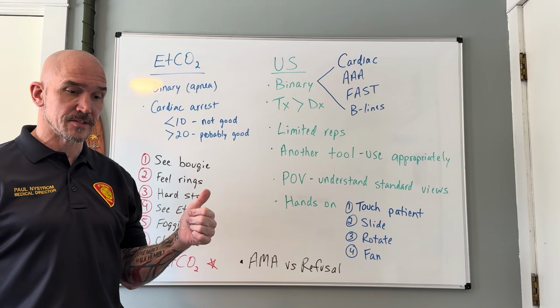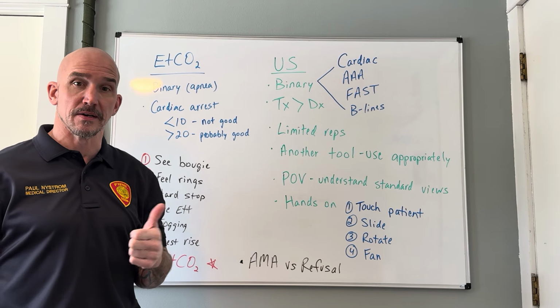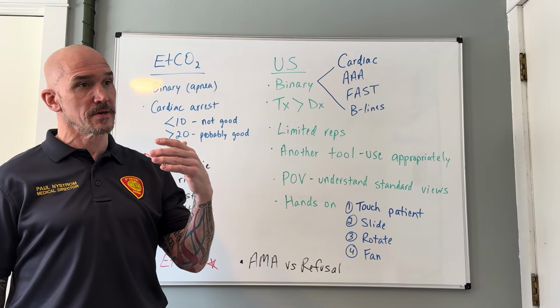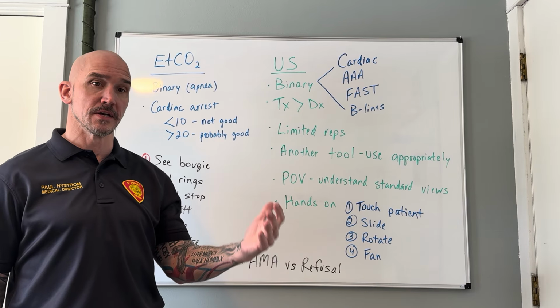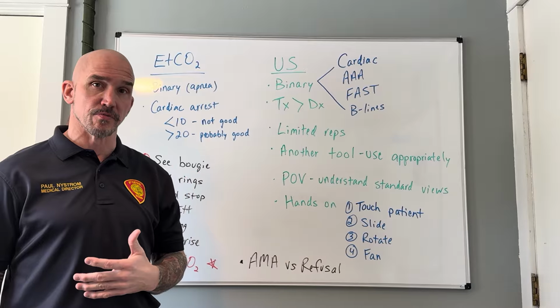I think the biggest takeaways are that I use it as a binary thing to look for apnea. So if a patient took a lot of something and they're down from their benzos or their alcohol or their opioids, whatever that is, and they're down, and you want to watch their respirations, that's a good tool to know if they're breathing or not.